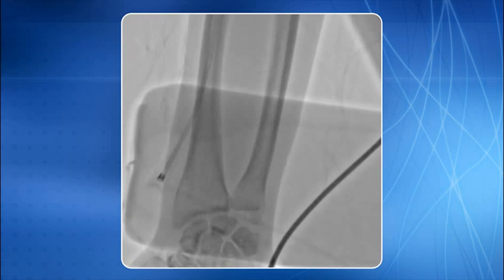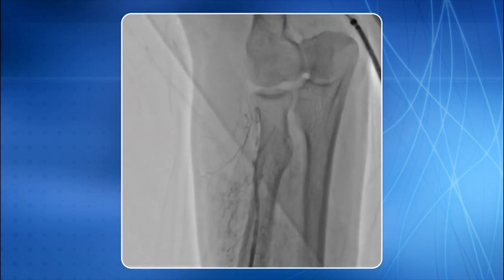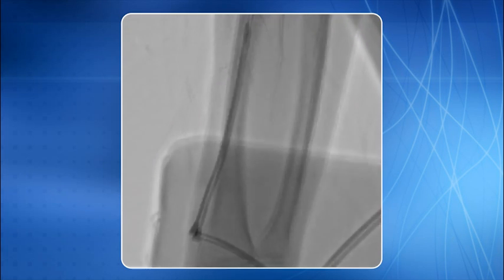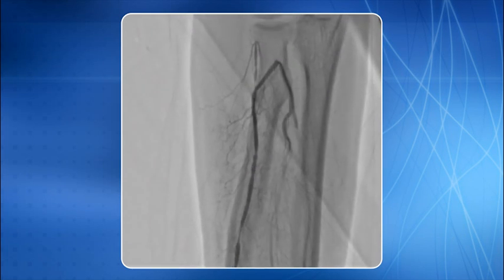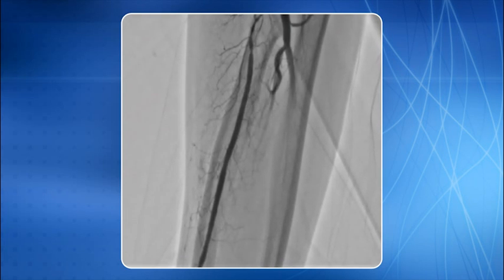Now, we will discuss radial artery spasm. This is an example of focal radial artery spasm right there, just beyond the tip of the introducer sheath. You can see after giving the spasmolytic cocktail, that is 200 mics of nitroglycerin and 5 milligram of diltiazem, how the spasm disappeared. This is an example of diffuse spasm of radial artery. Here is another example of diffuse radial artery spasm.